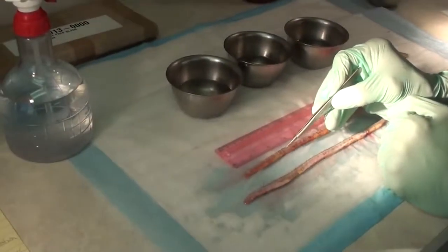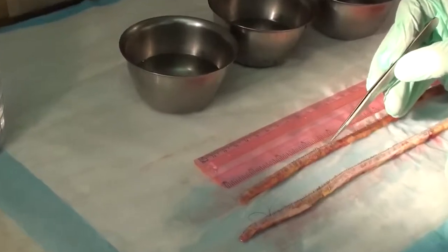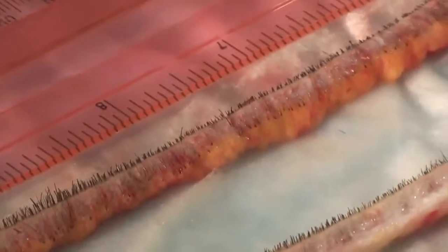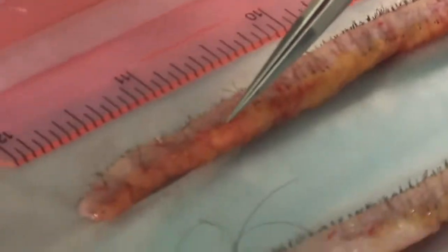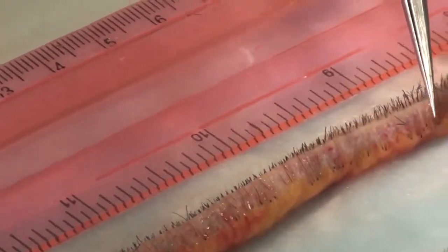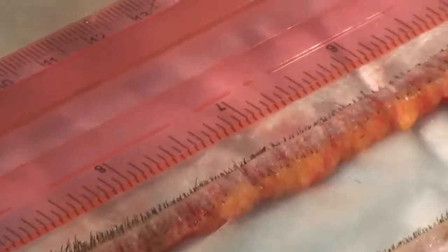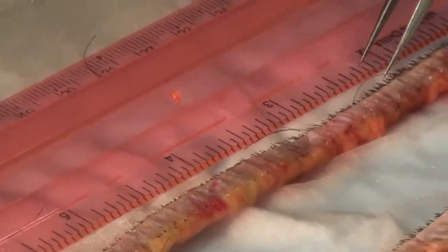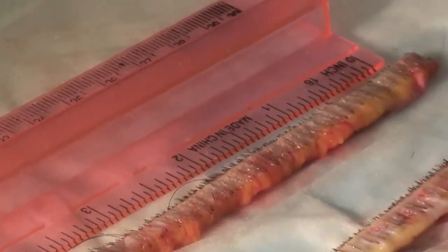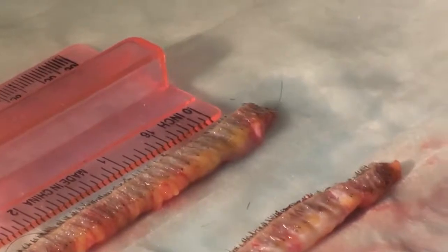It looks nice and clean. Same thing, we're just always checking for any transection. And you can see everything looks nice and clean. No transection the whole way throughout. Everything looks just perfect. So we got a really perfect yield. And you can just kind of follow it yourself, and you can see the bulb of the follicle is the little dots, and then that's the hair follicle, and then that's where it comes out. So you can see the top where it comes out. So the strips are just beautiful. We got a really beautiful harvest, which means we're going to be able to get a lot of hair for our patient. You can see it's nice and intact the entire way. There's virtually no transection on either of the strips, which means we're just going to get a lot of hair.